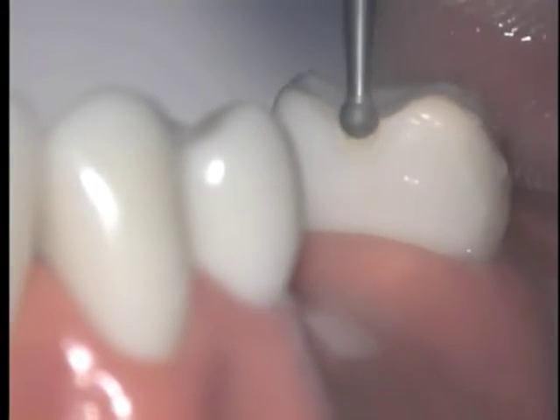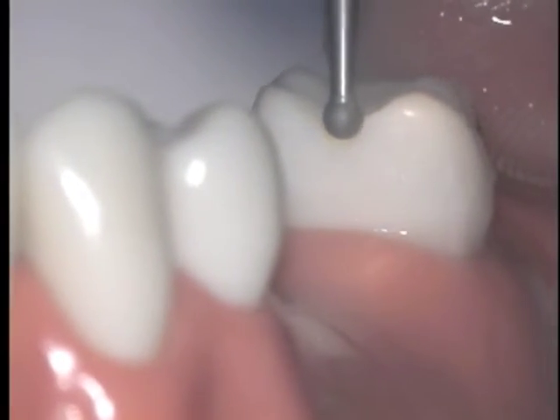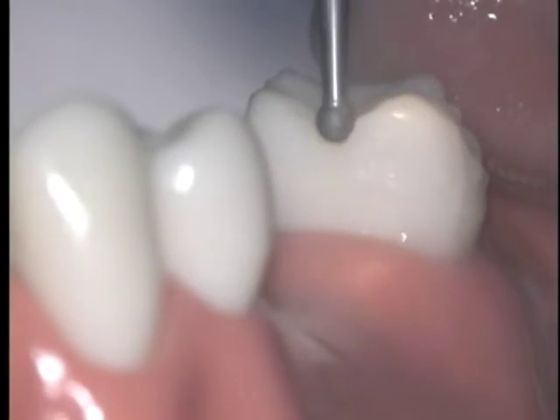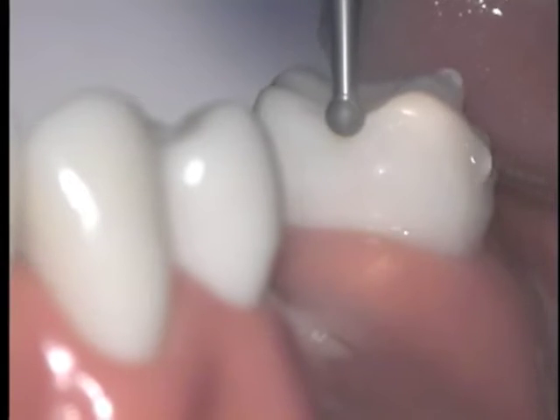Start your preparation in the mid-proximal surface and move your burr inward toward the nearest fossa on the occlusal surface — in this case the mesial fossa. Do not widen the preparation at this point yet.